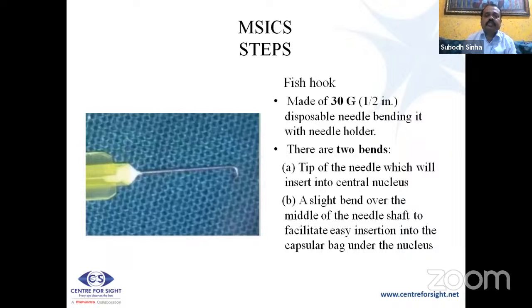So this is the fish hook technique. This fish hook is made of a 30 gauge needle. It has two bends, one here and one on this side. Also, this is one of the videos which I got from Lahan.